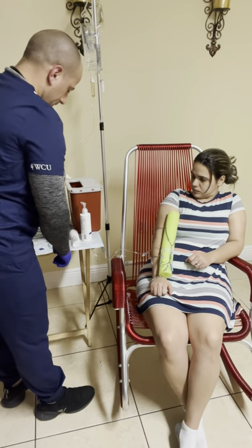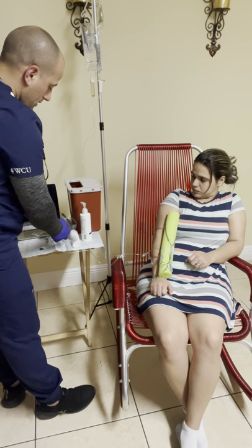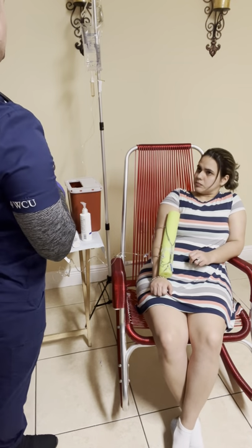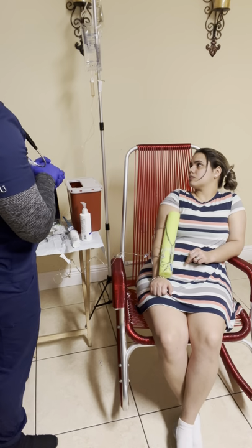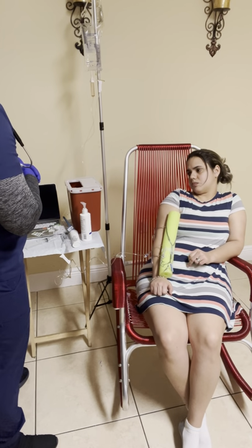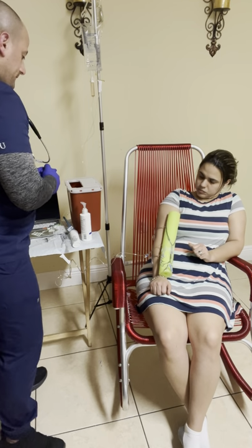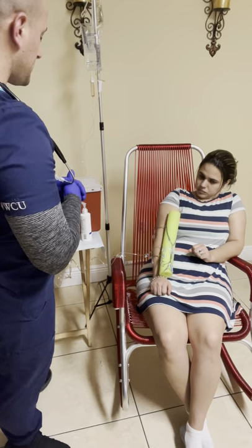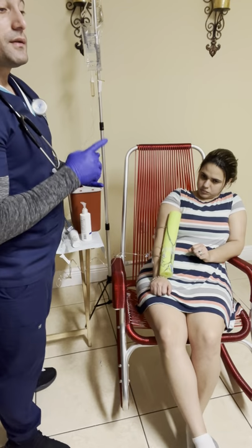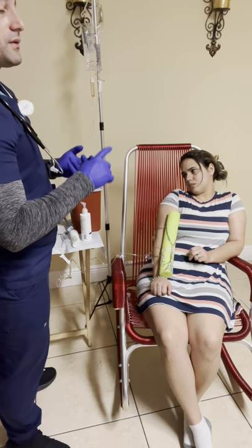I'm going to open the primary IV line, and I have to check if the drip is fine, the IV pump, everything looks fine. Previously to administering the medication, I have to check again if I have the correct medication, the correct patient, the correct route, the correct frequency.